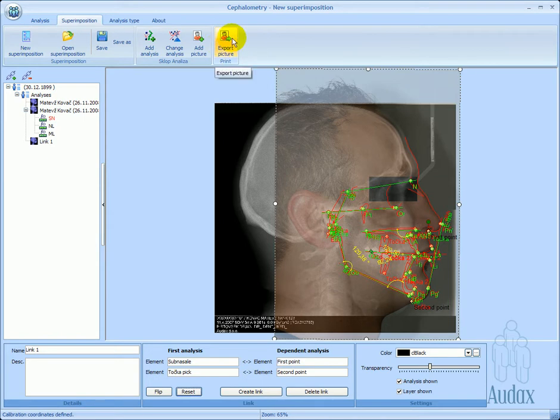The combined image can be exported to a file for future use and for documentation.